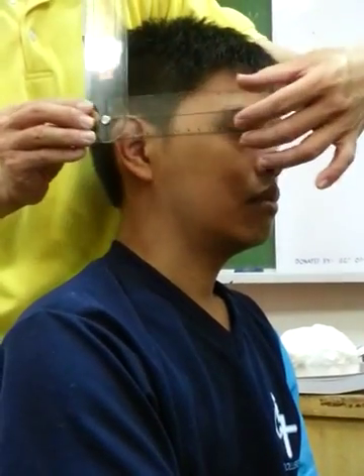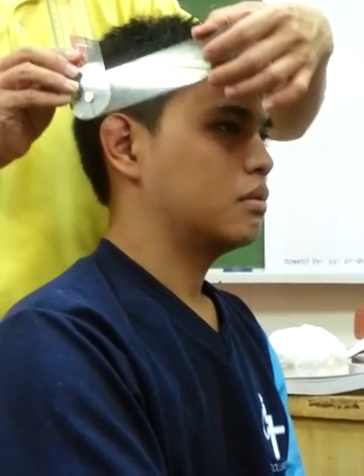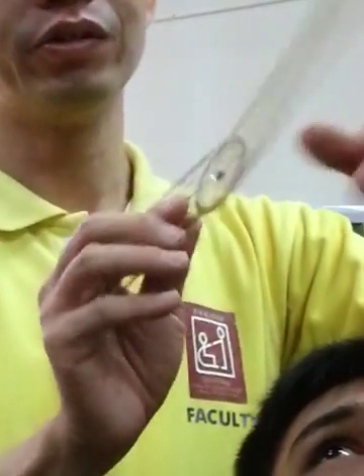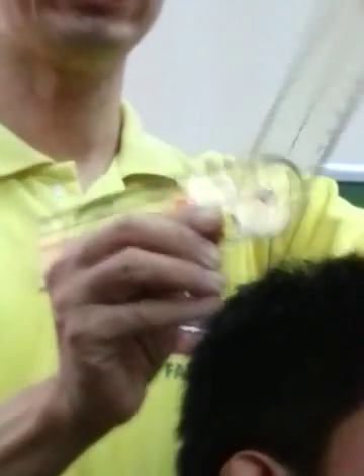How do you know that the arm of the goniometer is stationary, or the proximal arm? If you observe, the values are found on that arm — the numbers are there. So the one with the values marked on it is the stationary or proximal arm.